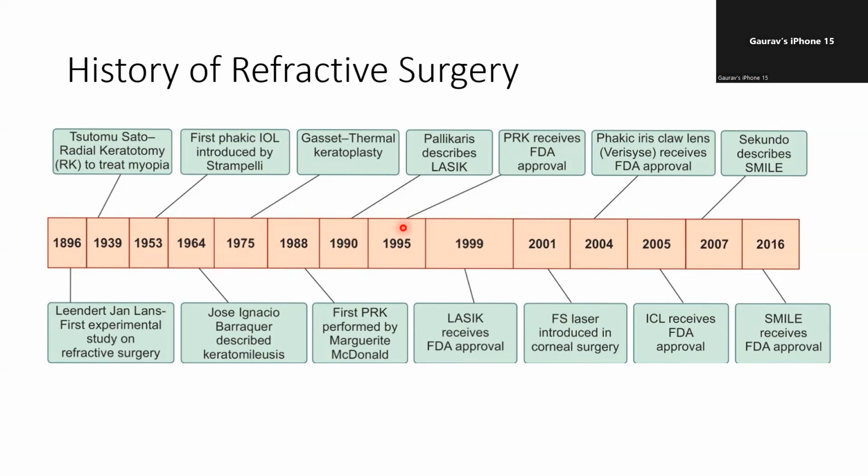In 1995, PRK received FDA approval. In 1999, LASIK received FDA approval. Then came the femtosecond laser, which was introduced in 2001. ICL received FDA approval in 2005. In 2007, SMILE was described for the first time by Dr. Sekundo. And in 2016, SMILE received FDA approval.